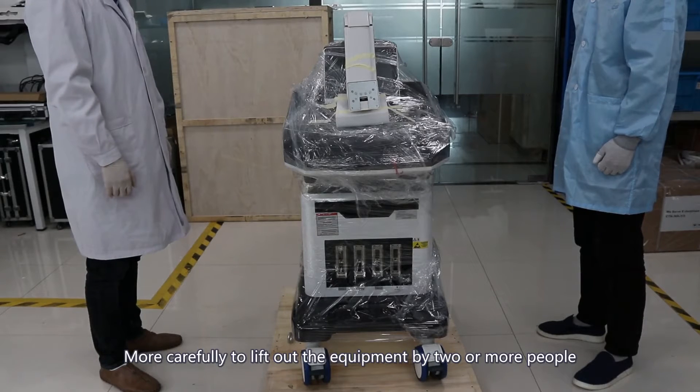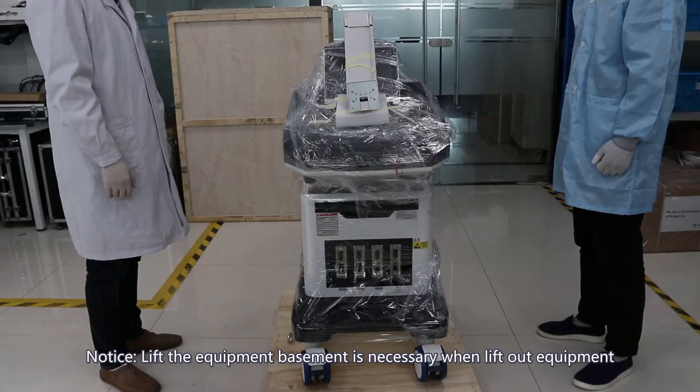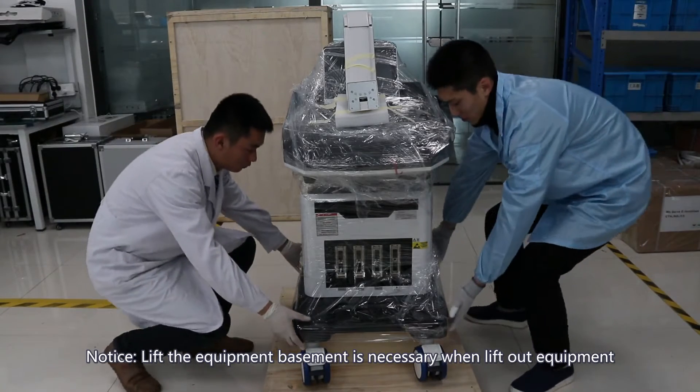Carefully lift out the equipment with two or more people. Note: lifting the equipment from the base is necessary when lifting out the equipment.